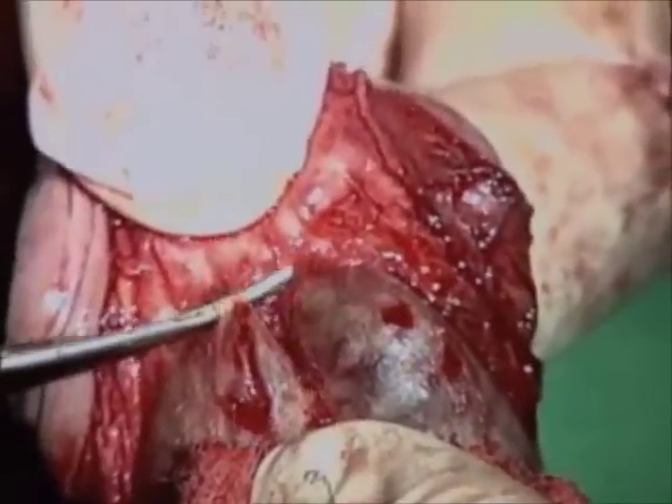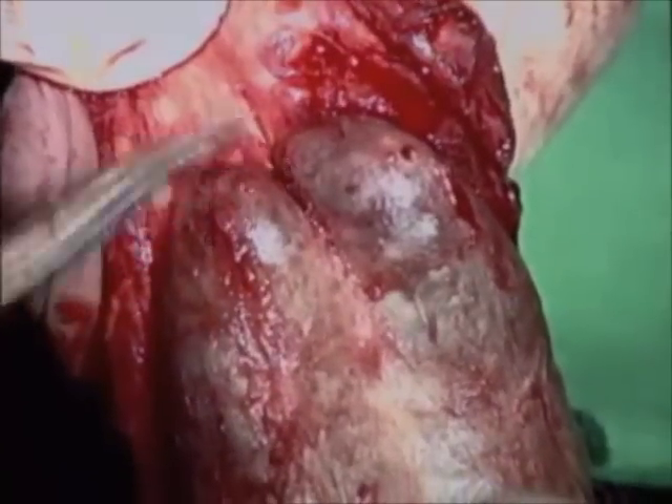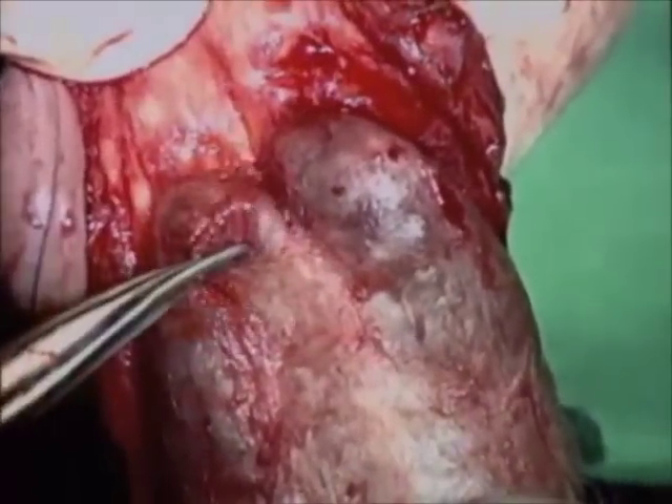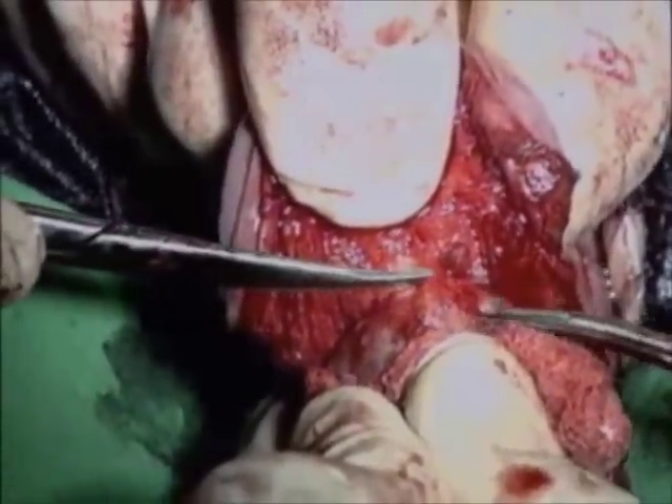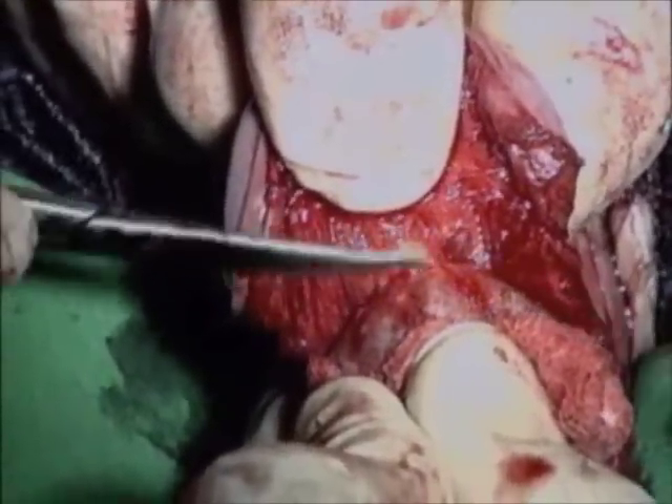The marked groove is visible ventrally due to a fibrous plaque located dorsally within the septum. Further dissection of the neurovascular bundle is continued through the plaque.